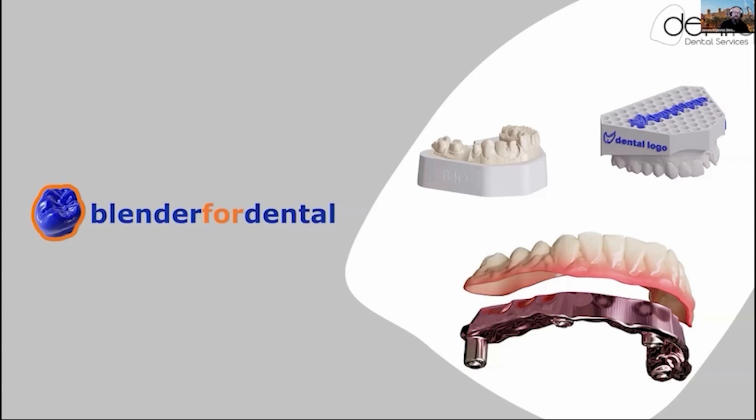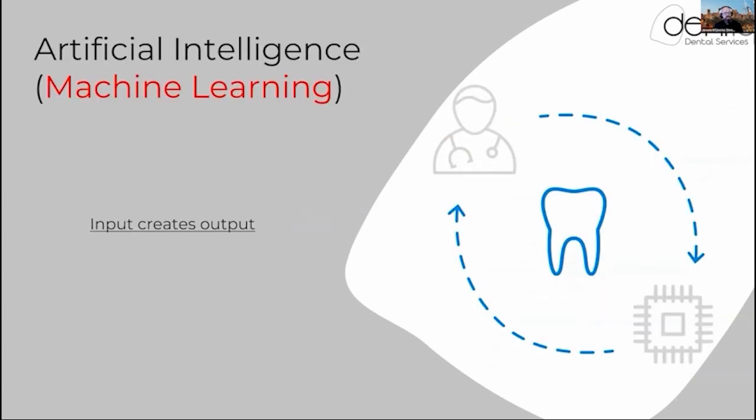What is really new with all we have is artificial intelligence. So we have machine learning and artificial intelligence, or actually I have to say machine learning is a part of artificial intelligence, because artificial intelligence is the entire name for a lot of things inside that field. But basically, we take the information we get when we design a crown.